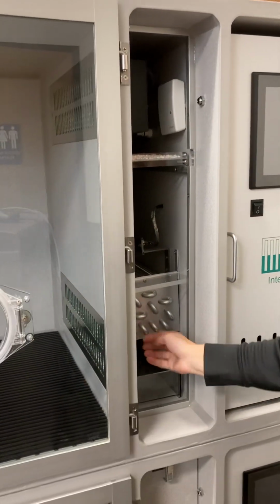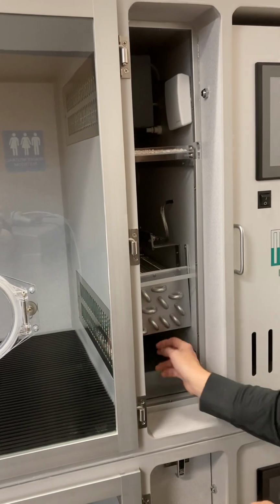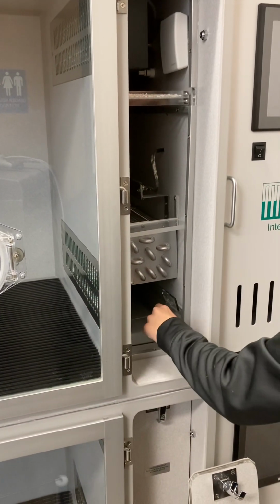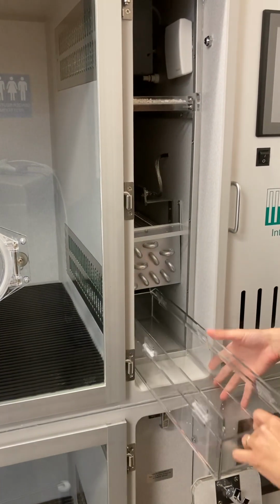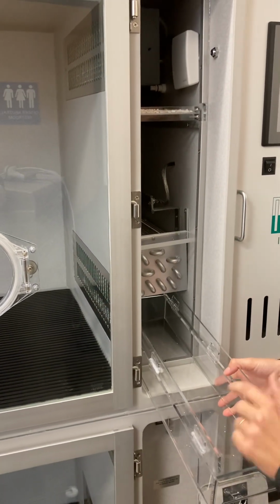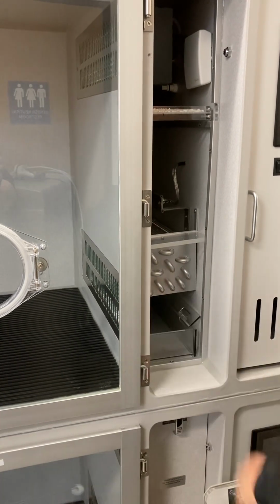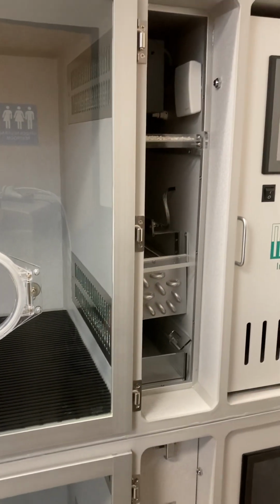Condenser coils are here. You should check them with your hand to make sure they're not wet. And the drip tray, these little wings fold in. You go ahead and lift it, pull it out, make sure it's dry. If it's not dry, wipe it out before you put it back. And always make sure to fold the wings back, otherwise it will just leak into the bottom.